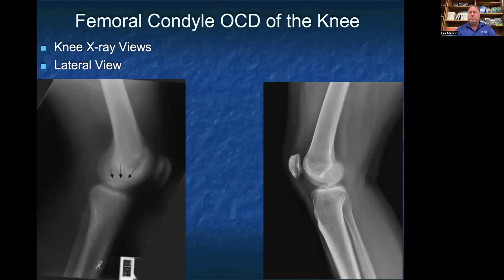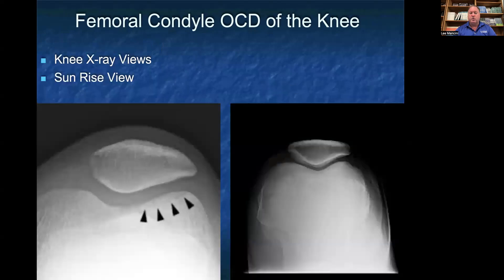On the sunrise view — so called because the patella is the sun coming up between the two mountain peaks of the femoral condyles — you have a normal sunrise view on the right, and on the left you can see this translucent appearance where all four black arrows are consistent with a femoral condyle OCD.